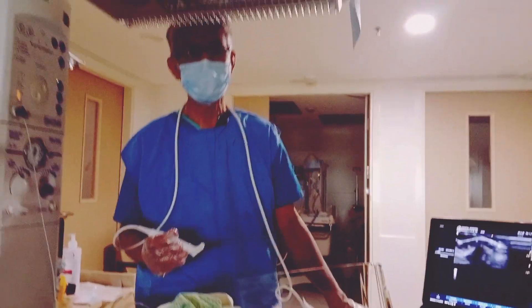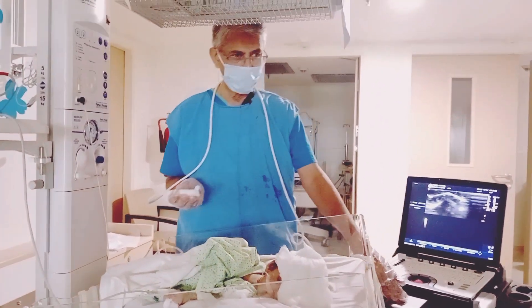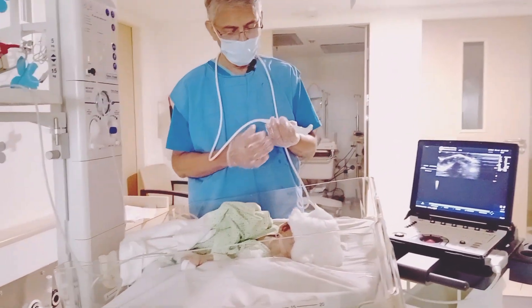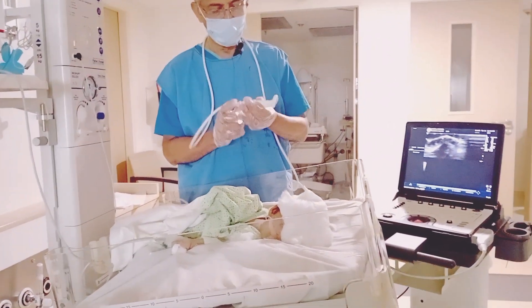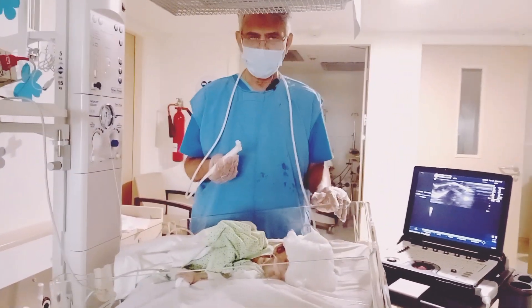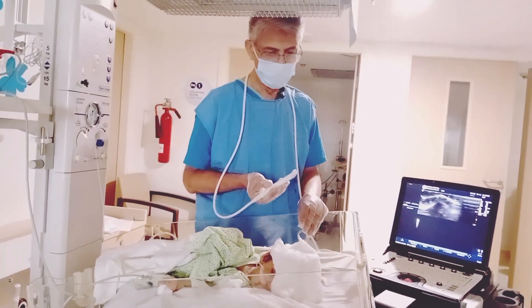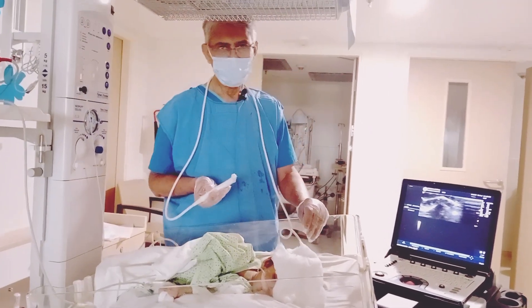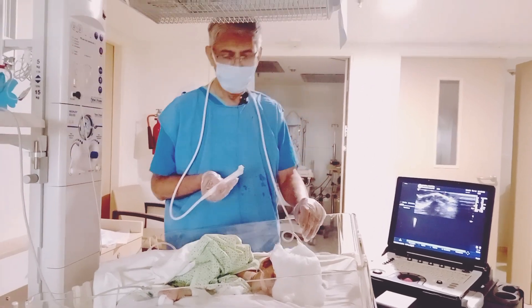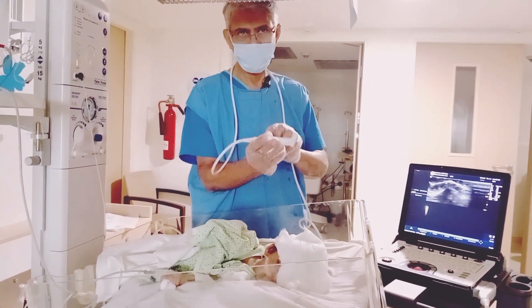Assessment of sickness in neonates using sonography. Today we will perform Doppler ultrasound of the radial artery. Radial artery Doppler is very important because in sick neonates, if umbilical artery cannulation cannot be done, the only other artery which can be cannulated is the radial artery.